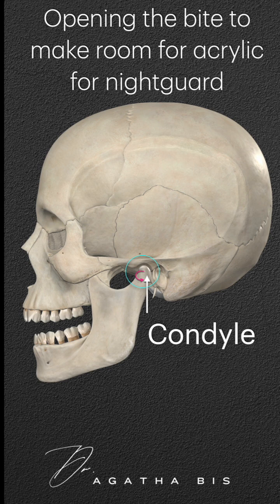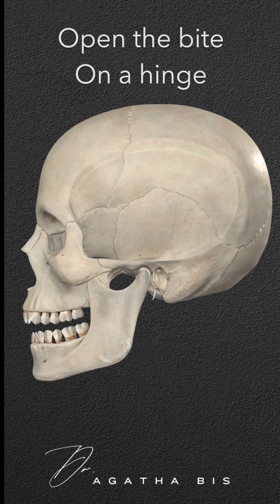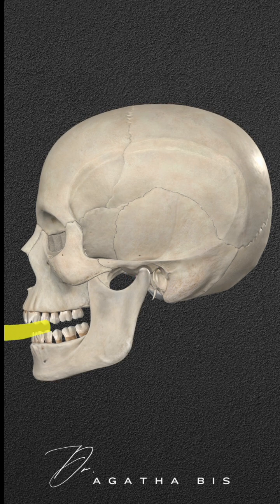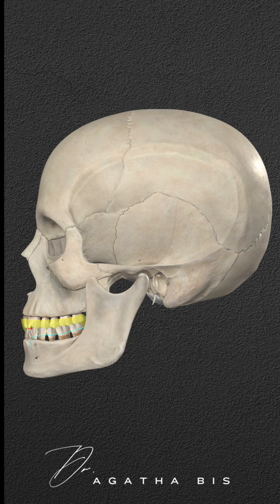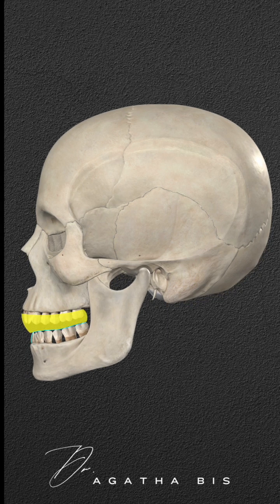Why is this a problem? I'm about to show you. When a lab makes a night guard, it's usually for the upper teeth, opening the bite on a hinge. Where do the lower teeth go when you hinge the mandible at the condyle level? They shift slightly backwards. This means that the mandible is retruded when the bite opens on a hinge.